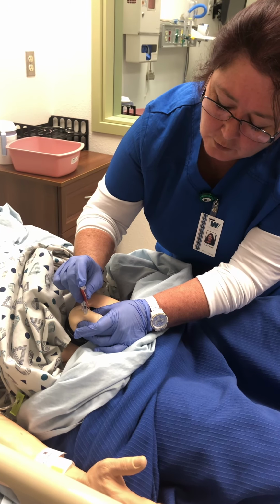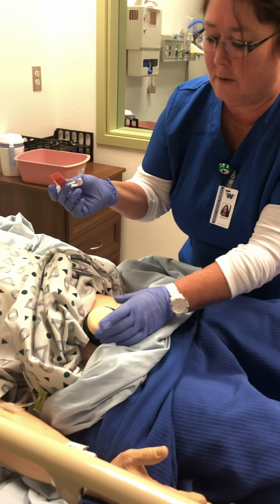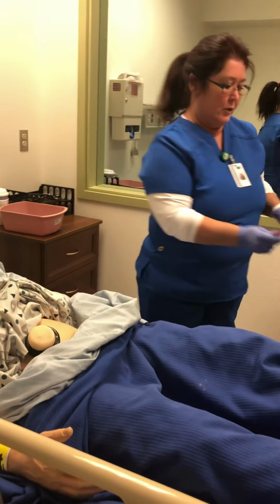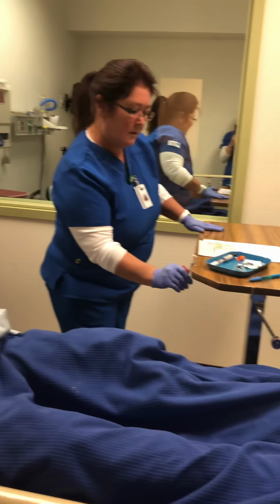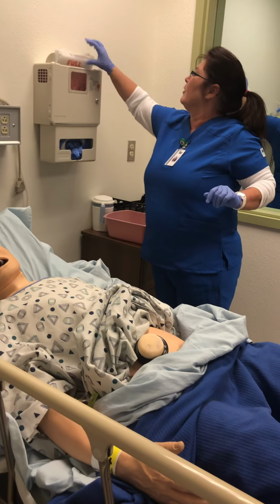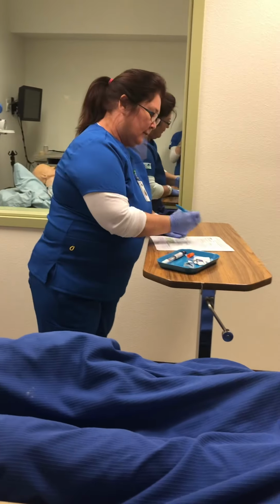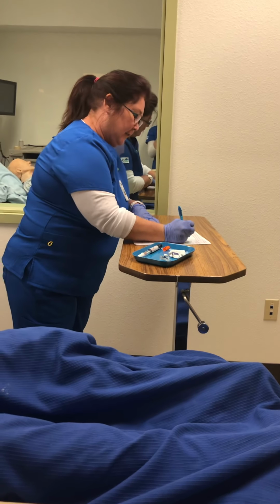And doing good, Shirley. Fabulous. Okay. So then I'm going to make sure that I lock my needle, and it goes in a sharps container. Okay, so I'm going to initial off that one, that we gave that at 5:30.